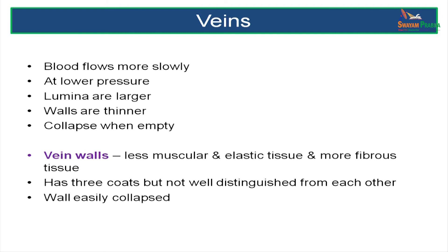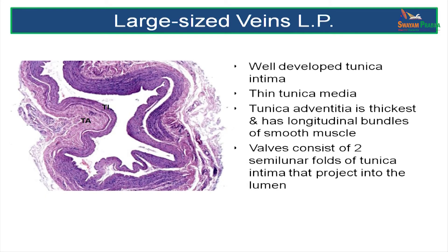Now let us study veins. Veins are larger vessels with thinner walls, having a collapsed lumen and blood at lower pressure. The vein walls have less muscle and more connective tissue. The tunica media of a vein is much thinner than that of an artery, while the tunica adventitia is more developed than in the arterial wall. In a slide of a large sized vein, note the collapsed state of its wall with a thin tunica media and a very thick tunica adventitia. The tunica adventitia has longitudinal bundles of smooth muscle.